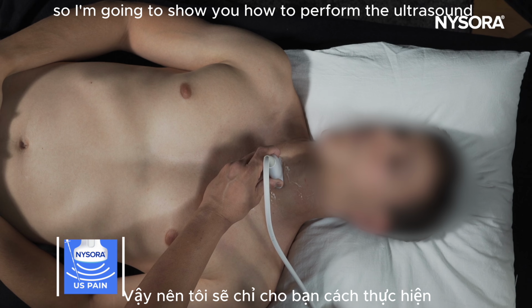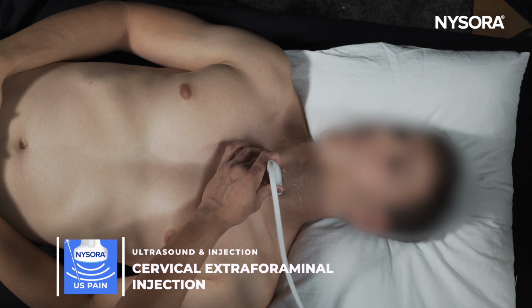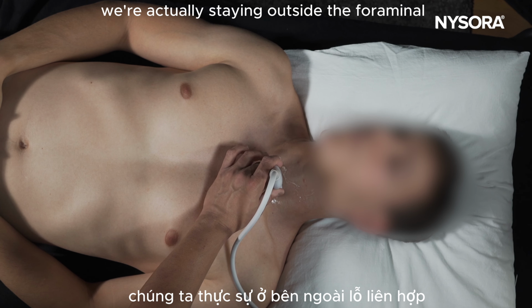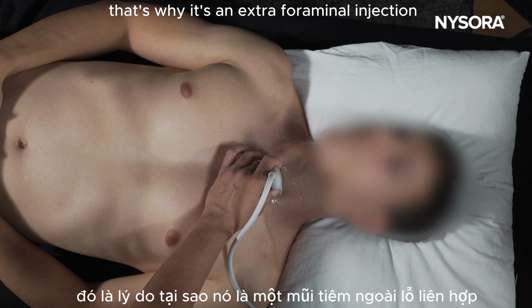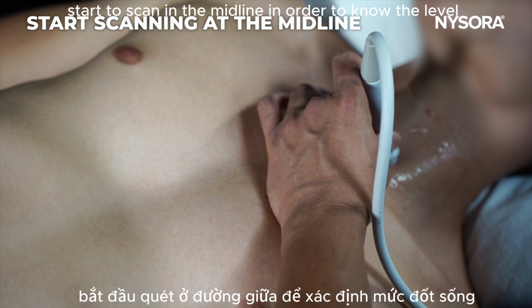So I'm going to show you how to perform the ultrasound guided extraforaminal injection. When we use ultrasound, we are not doing a transforaminal injection. We are actually staying outside the foramen. That's why it's an extraforaminal injection. Start to scan in the midline in order to know the level.